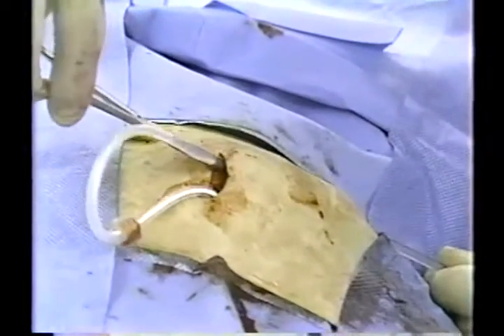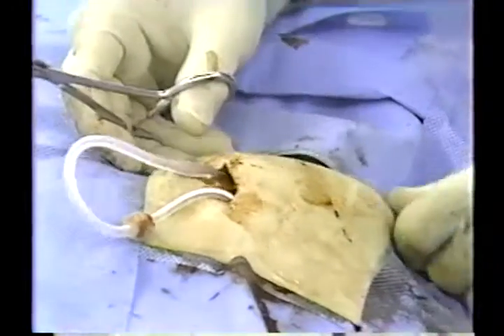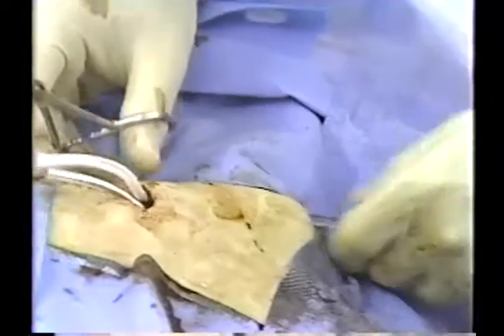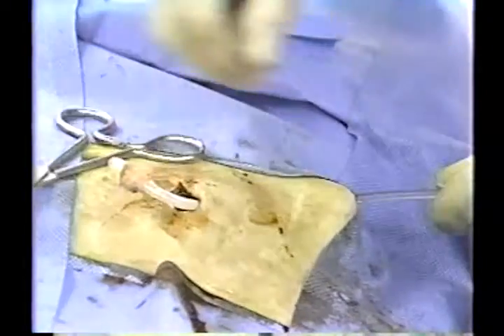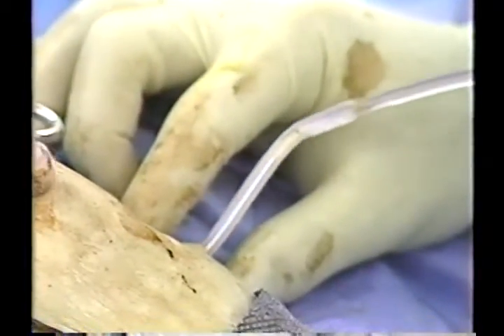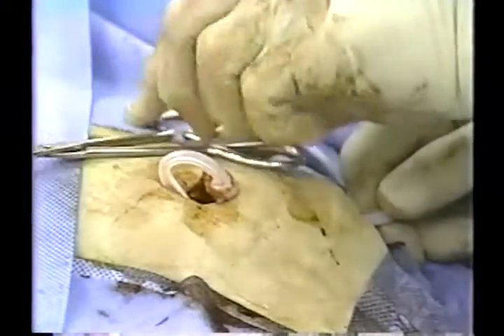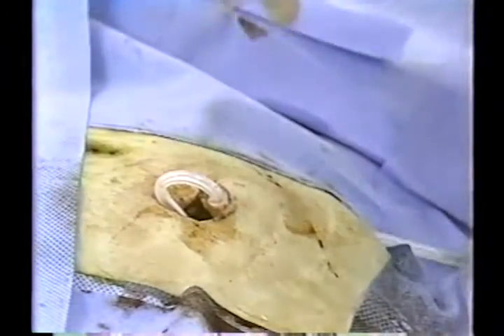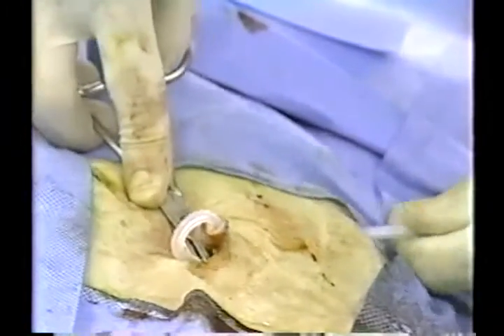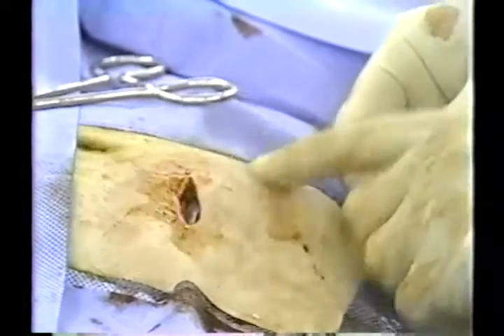A pair of hemostats is used to dilate a position and width for the subcutaneous cuff. The tunneler and catheter are pulled through the exit skin site. At the primary incision, a hemostat is used to grasp the lower cuff and prevent dislodging the catheter tip as the tunneler is withdrawn.